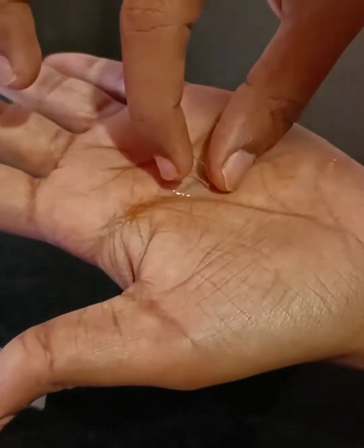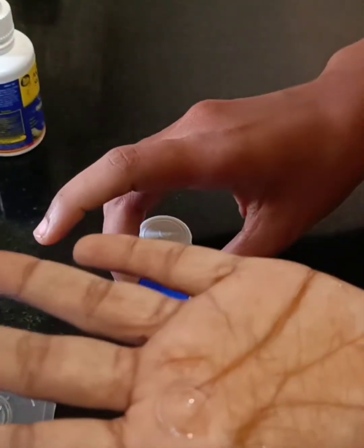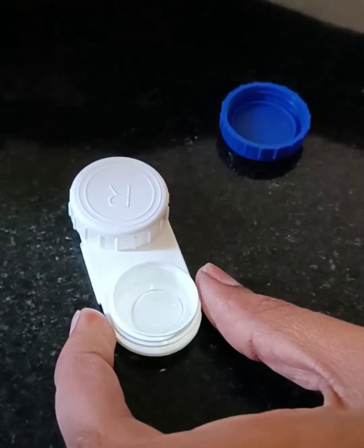After that, pour away the contact lens solution, take the contact lens with your index finger and keep it inside the contact lens case. Pour the contact lens solution inside it in such a way that the contact lens should be submerged under the solution.